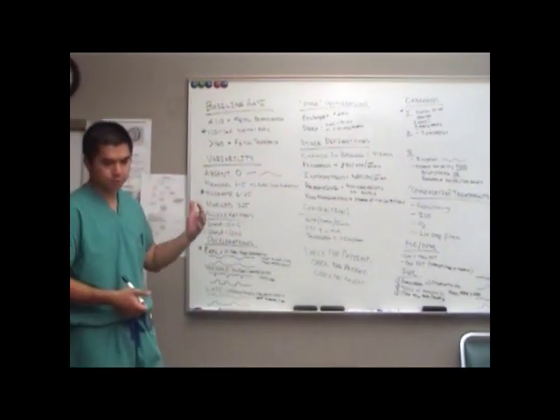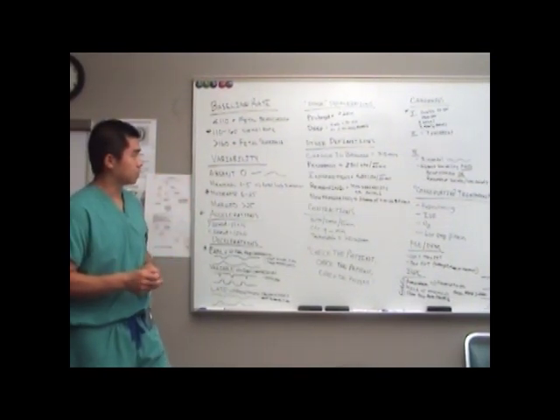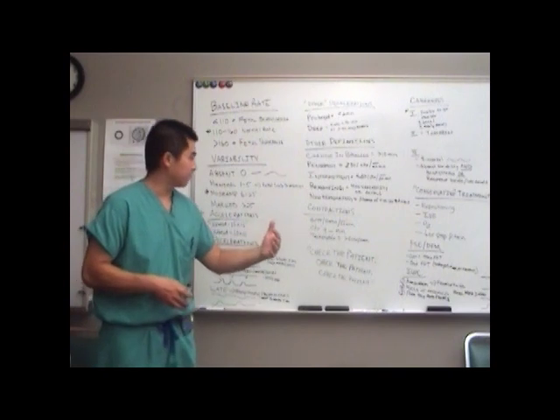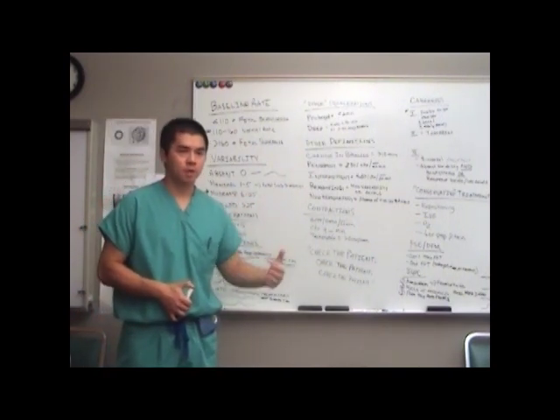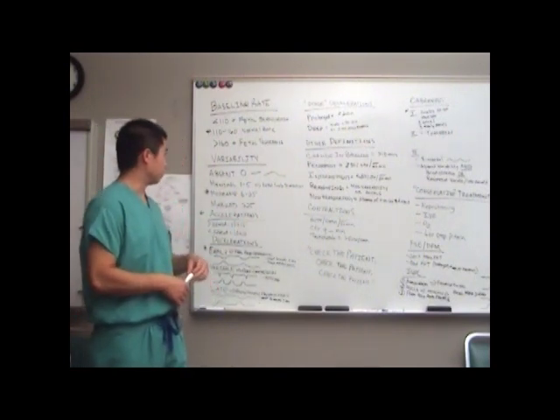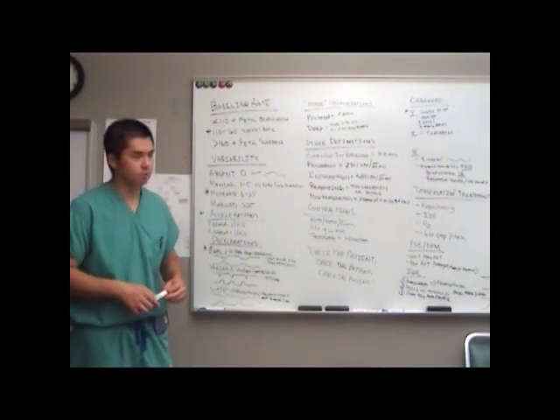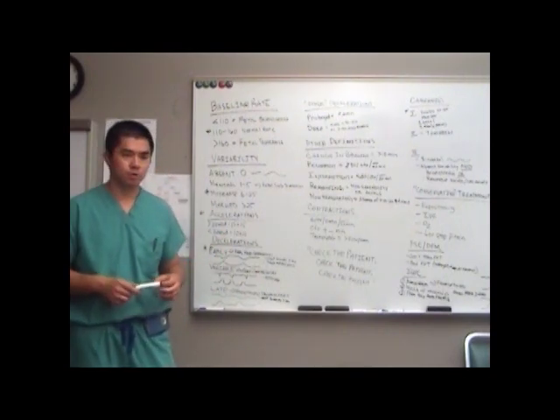So as long as you repeat to yourself these definitions as you're going through them, especially when you're starting off, every fetal heart tracing that you read, go through these definitions in your mind until you have them down, and teach them to others until you have them down. Only then will you get real comfortable with reading fetal heart tones. It's probably the most important thing to learn your first month as you're going through OB.